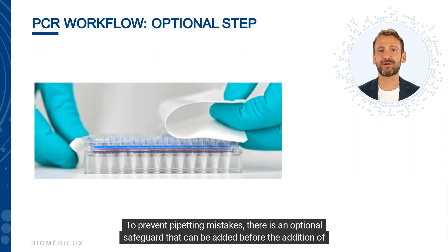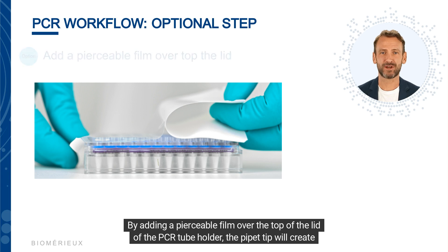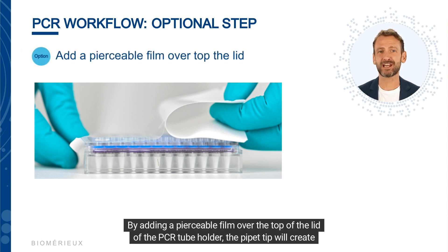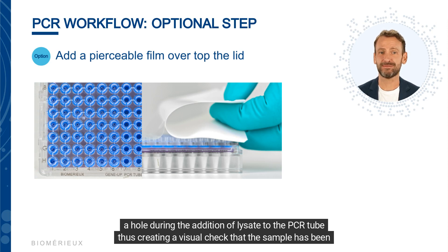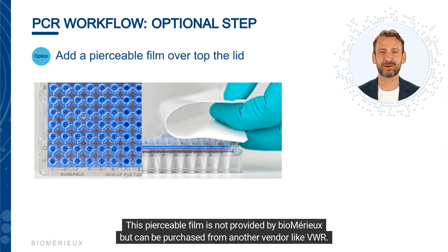To prevent pipetting mistakes, there is an optional safeguard that can be added before the addition of the lysate: a pierceable film placed over the top of the lid of the PCR tube holder. The pipette tip will create a hole during the addition of lysate, creating a visual check that the sample has been added or is still required. This pierceable film is not provided by bioMérieux but can be purchased from another vendor such as VWR.